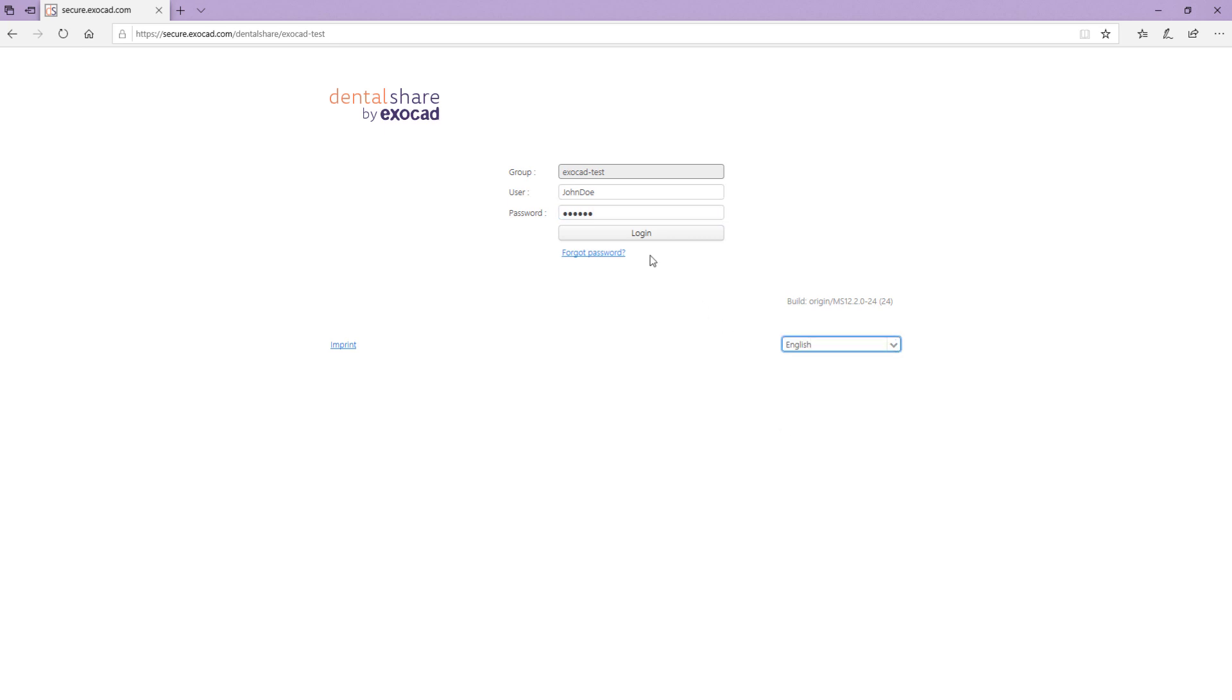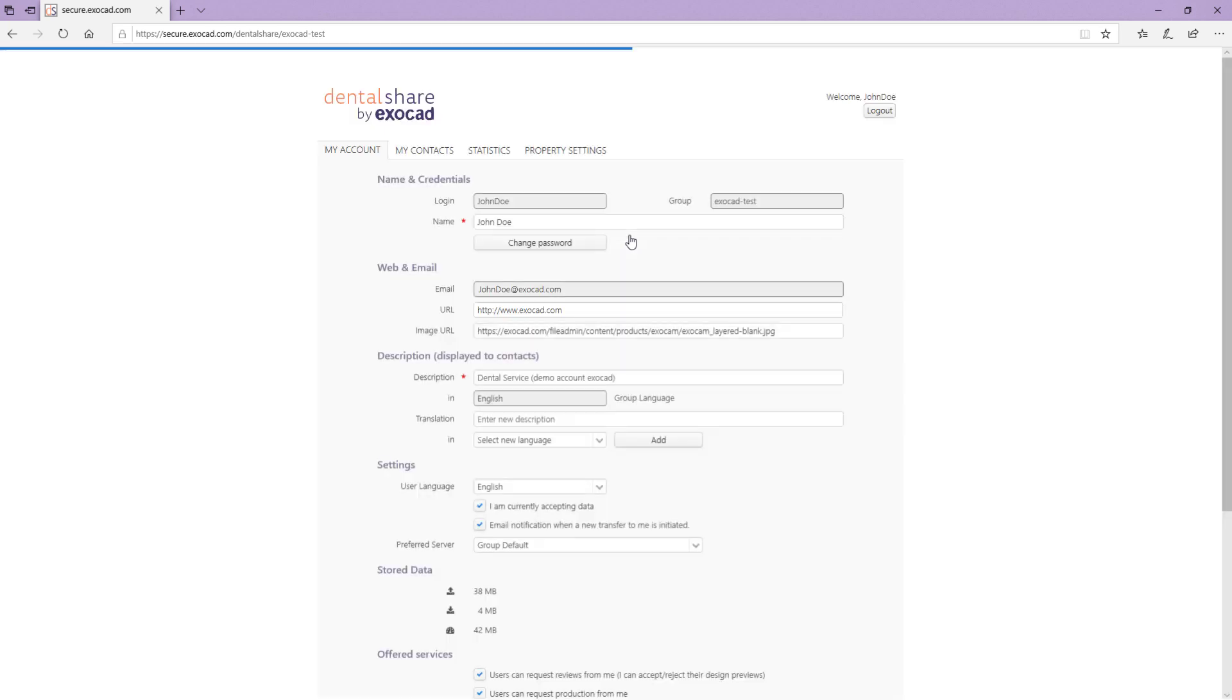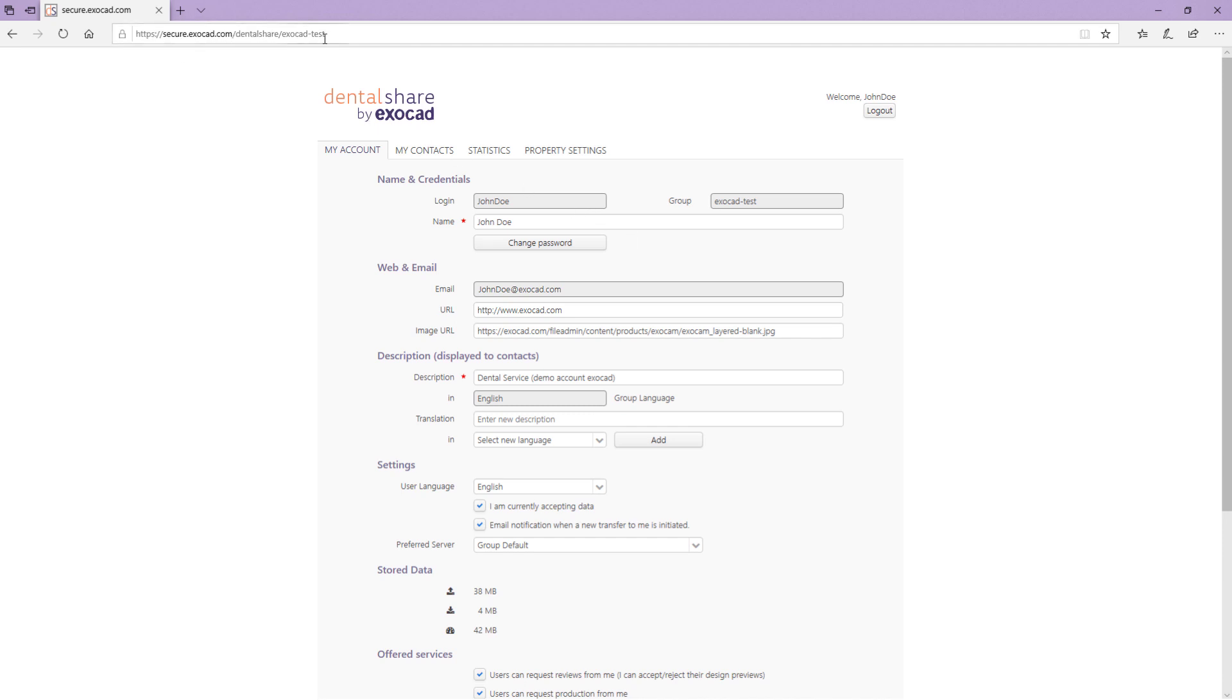As soon as you have accepted the terms and conditions, you are logged in to DentalShare and can see your account page and the account tabs. Note, DentalShare can be accessed via DentalDB and the DentalShare account can be managed via the secure web page.